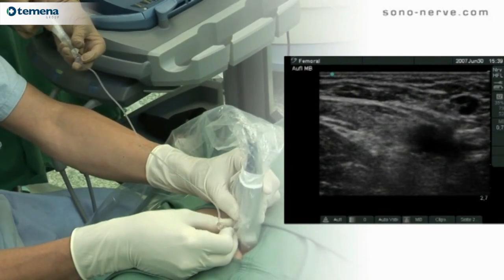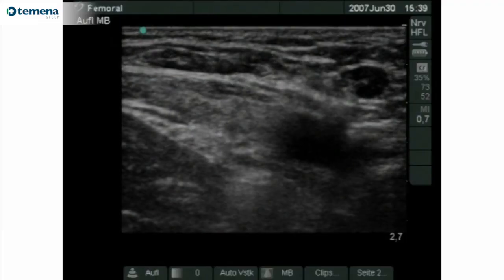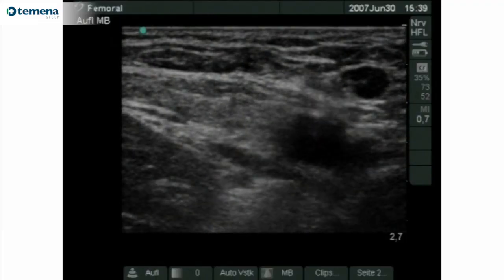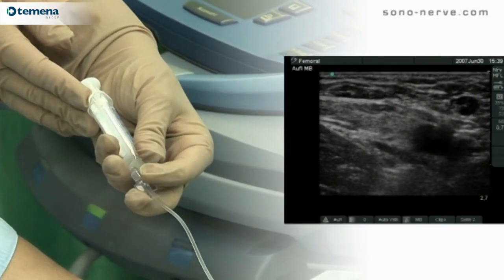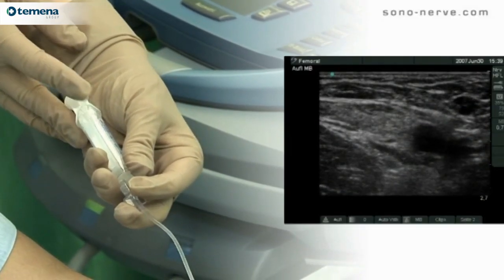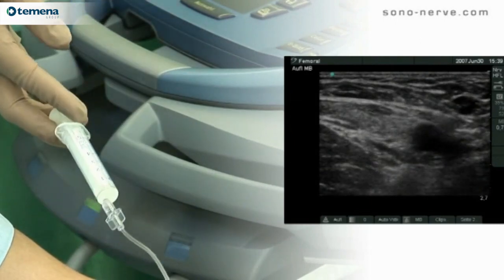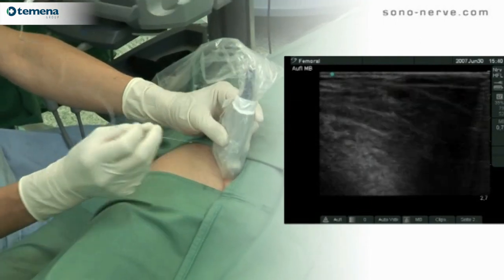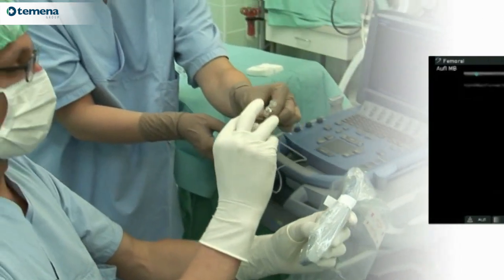The needle is passed towards the nerve and placed in close proximity. It's very important in this situation to control the tip of the needle such that it doesn't overshoot and damage structures beyond the fascial layer.